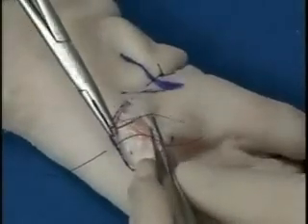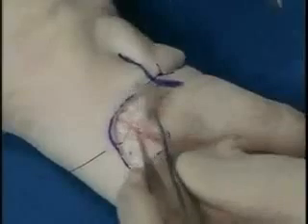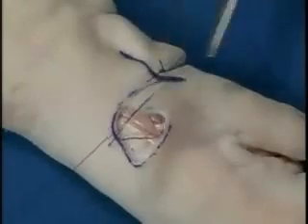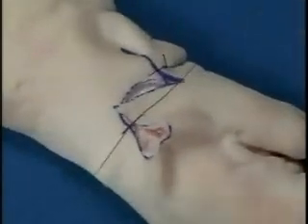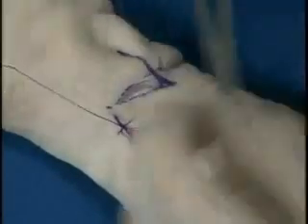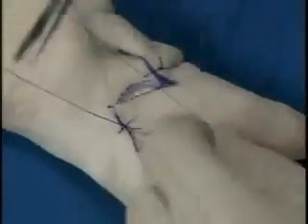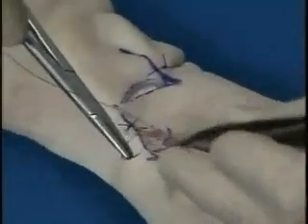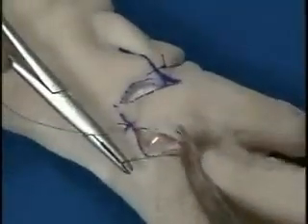Notice this is a triangle being rotated into a circular defect. So we need to be able to trim the excess of that flap so as it fits and it will inset nicely into the circular defect. Here we see the dog ear. So we place a suture to close this end of the flap.